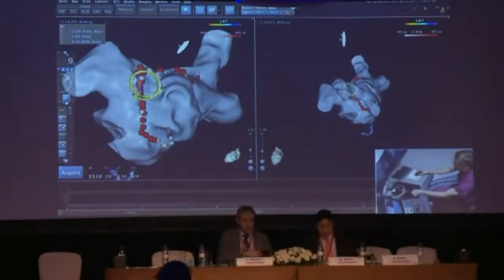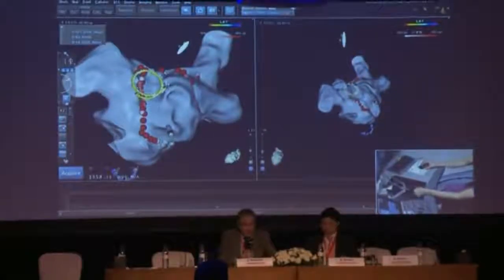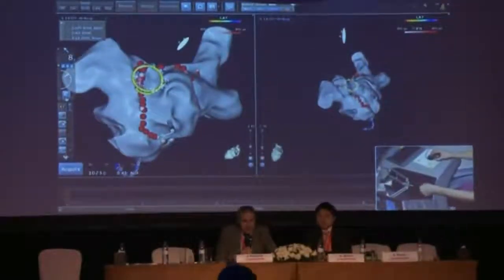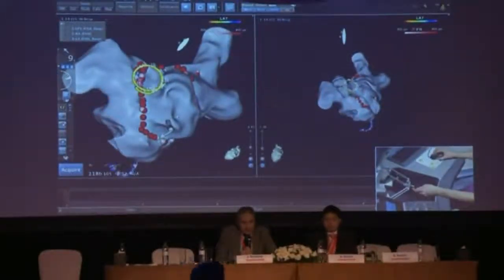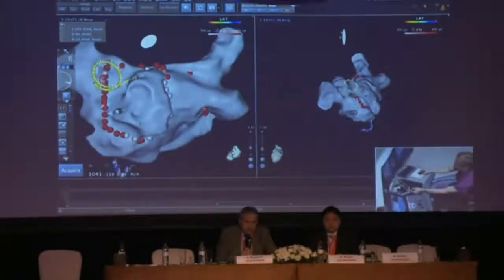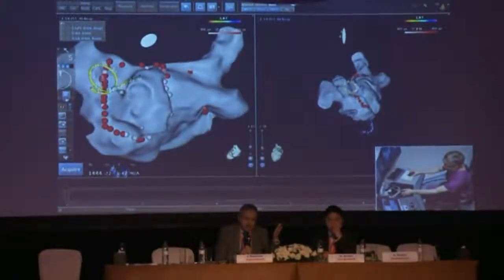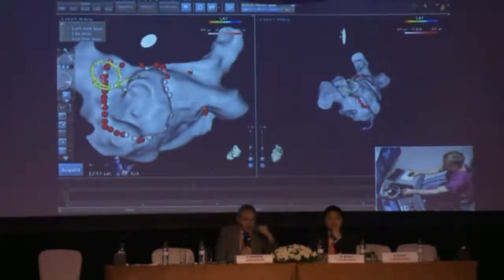And I am very careful. I always go on this side of the ridge, and then I'll often find there's a little breakthrough just here where this tissue is particularly thick, where I need to touch up. So is this your strategy, that you first go from the appendage side of the ridge and then you go from inside, or how do you do that routinely?